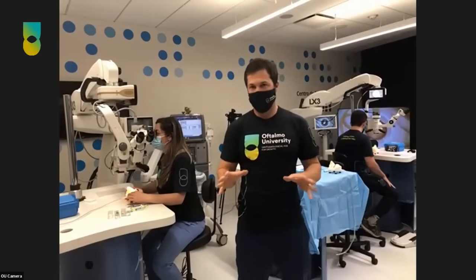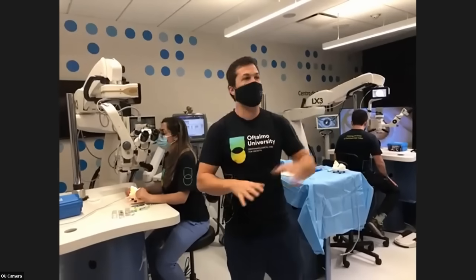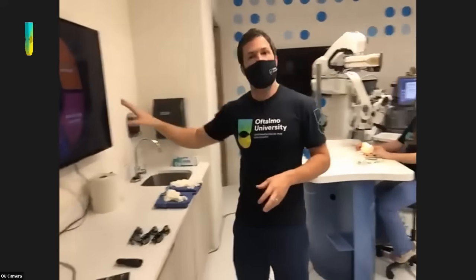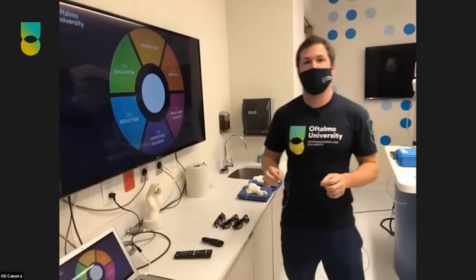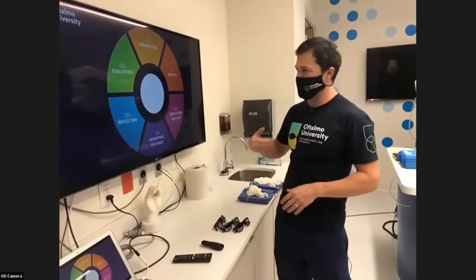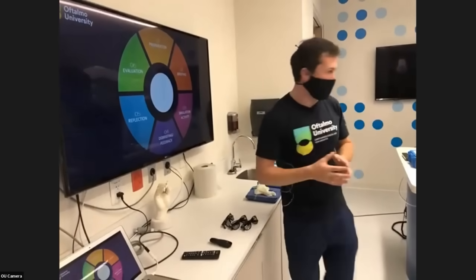So let's move fast, and I'm going to show you what the setting looks like. You're going to see a lot of cameras surrounding us because that's the key. The first thing is I'm going to have this screen to show what's going to happen. We're going to behave like a professional simulation center. We're going to have a preparation of the students, a briefing, simulation activity, debriefing, reflection, and evaluation of what's happening.